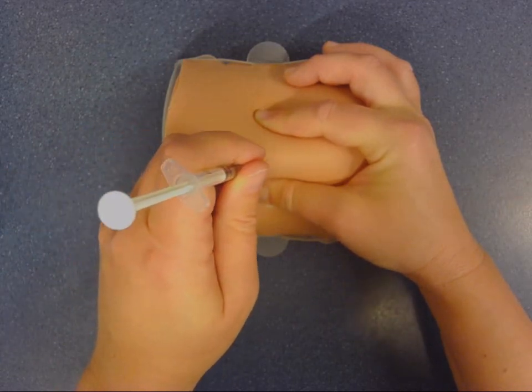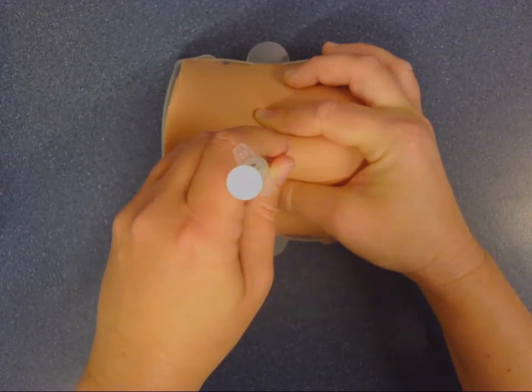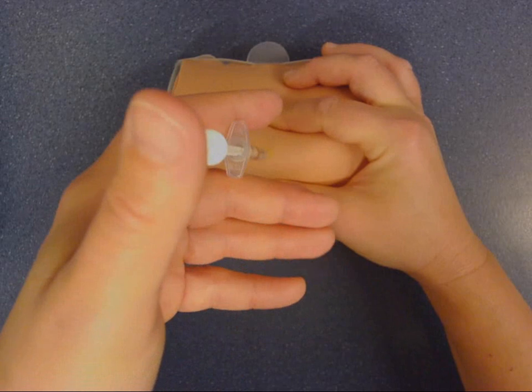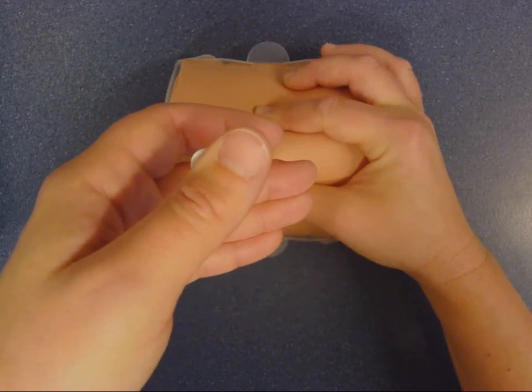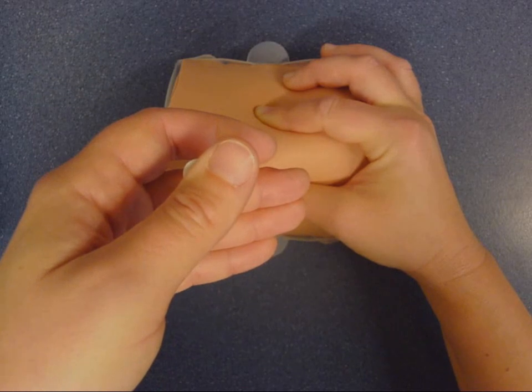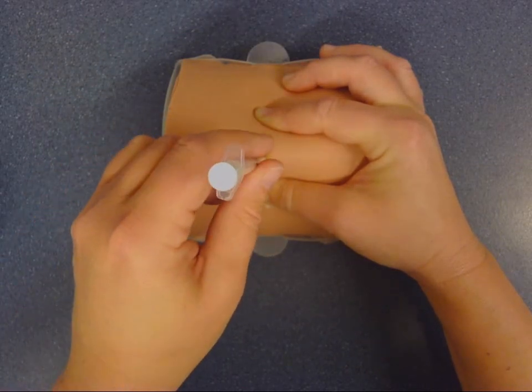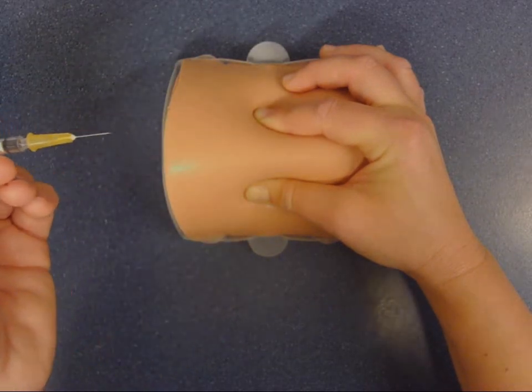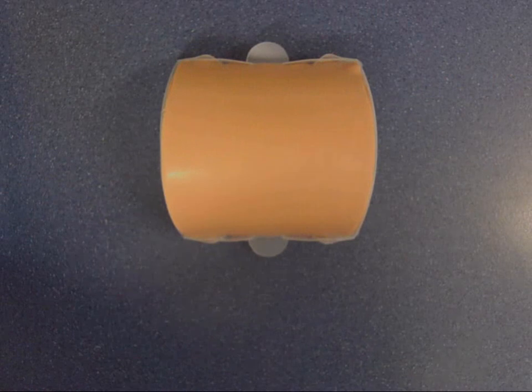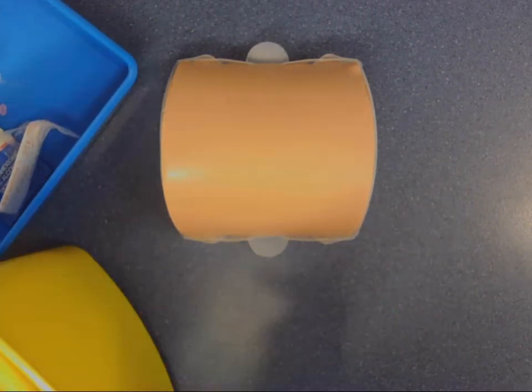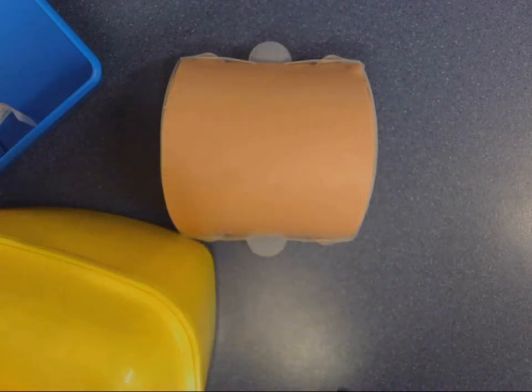I'm going straight down into the skin. All the way down. And I'm going to slowly inject my drug. Withdraw the needle. And release my fingers. I put my drug with the needle straight into the sharps bin.